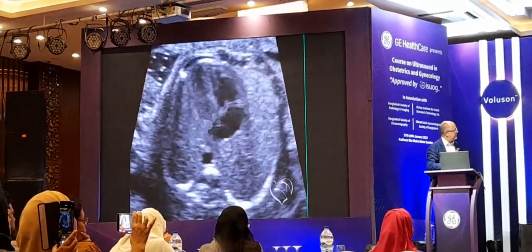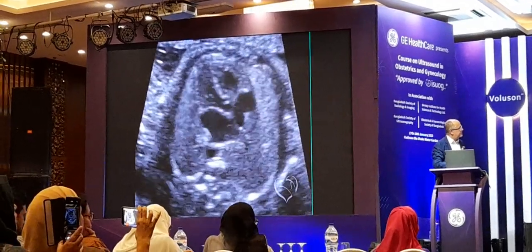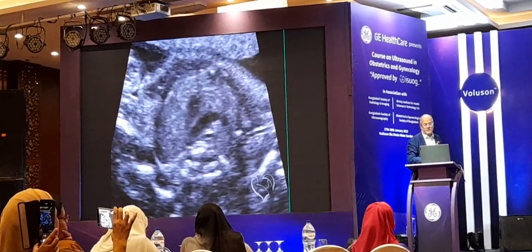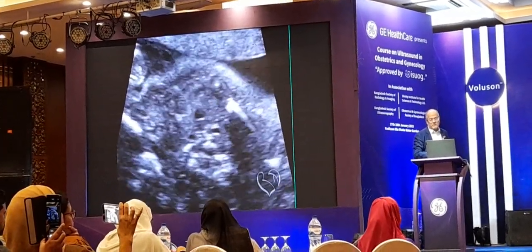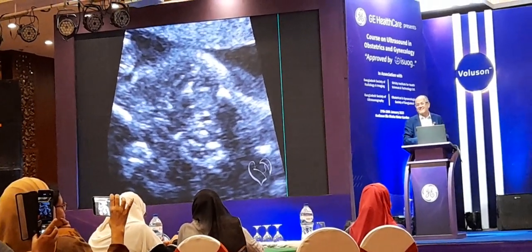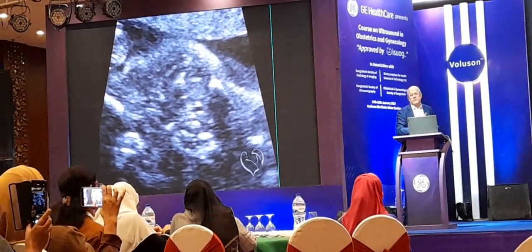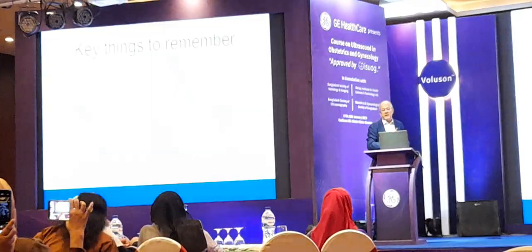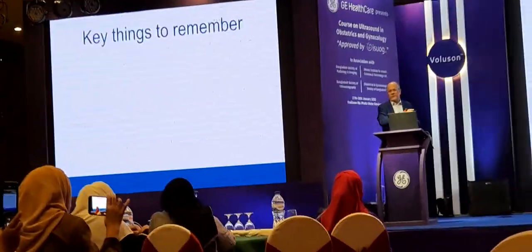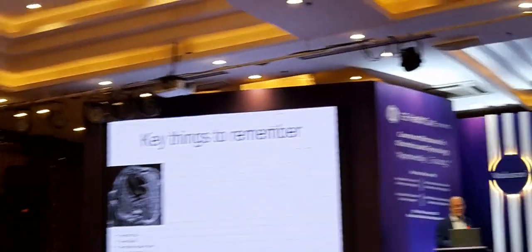Good. Okay, so we've come from four-chamber view to left ventricular outflow tract, right ventricular outflow tract, the three vessel view. Done a simple sweep, but we've covered so much on this short journey. Remember all the little structures, remember all the little clues that we talked about, and try to remember some key things that I think you should remember. That we've covered so much, I'm not going to ask you to remember everything, but remember these key things.